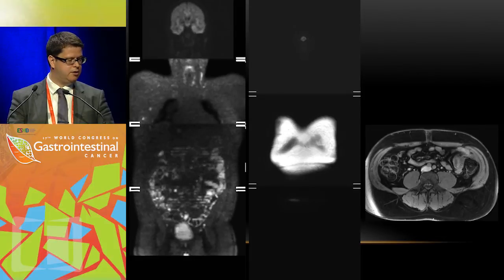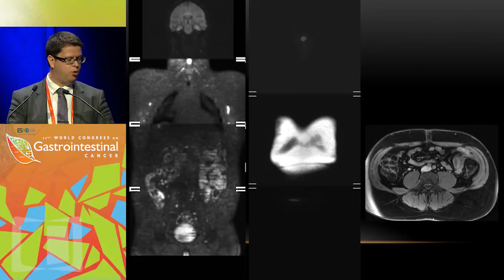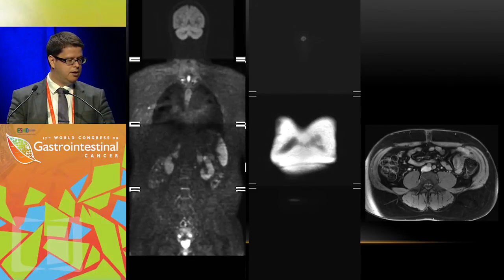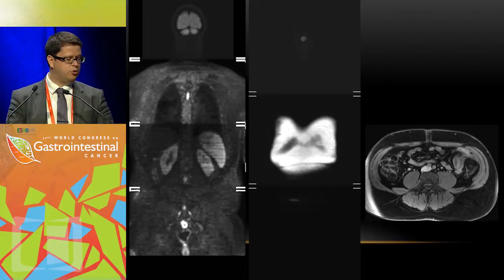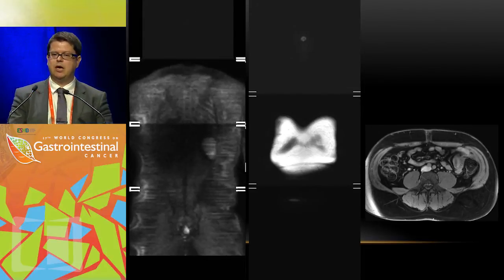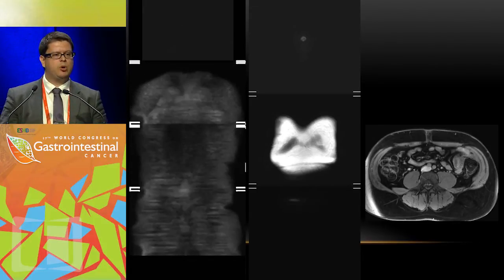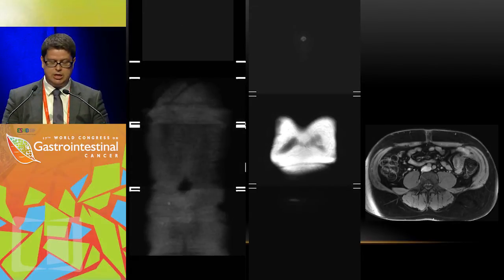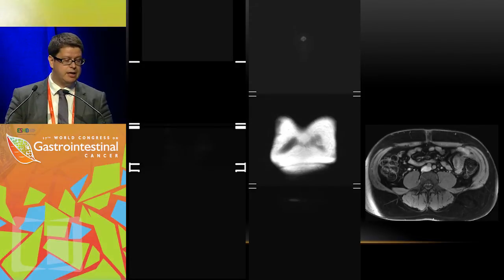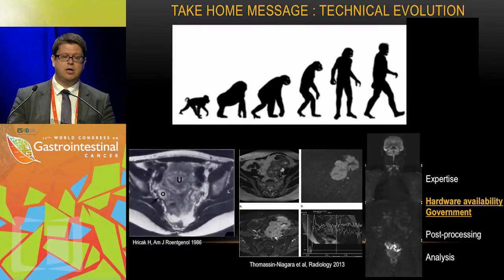And you see already bright dots all over the liver. Also here. There, there. And in total, we actually measured 18 liver metastases in this patient. And this is the advantage, recently published also. Microstructural imaging is actually independent of the effects of chemotherapy or radiotherapy. The inflammation is not visible in the scan, and therefore it is very excellent for post-treatment imaging.